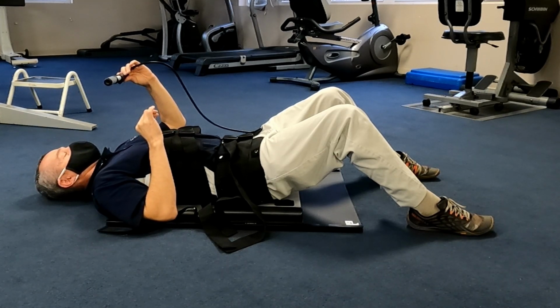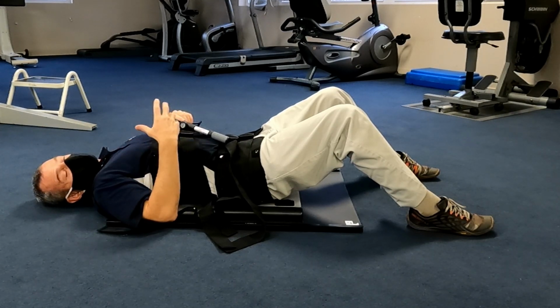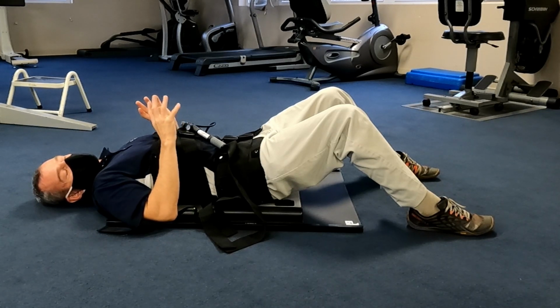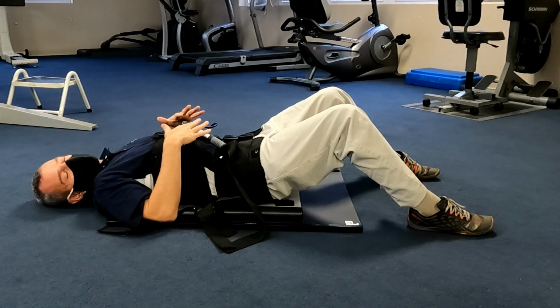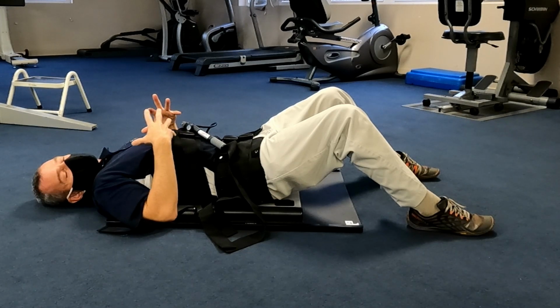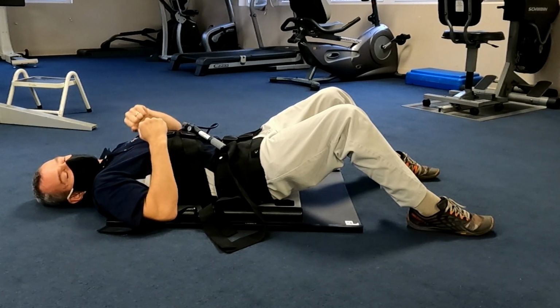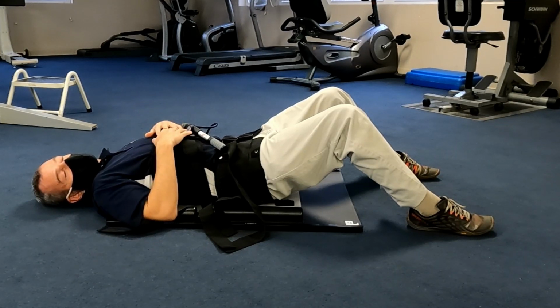I'm at about 20 pounds of pressure. The recommendation goes up to like 70 pounds, and there's a percentage of body weight and all this kind of stuff. For the way I would use a lumbar traction unit, I'd be done at 20 to 40 pounds. More than that, I feel like it's too easy to create a reflexive spasm. But at 20 to 40 pounds, it's like, oh, it feels kind of good.